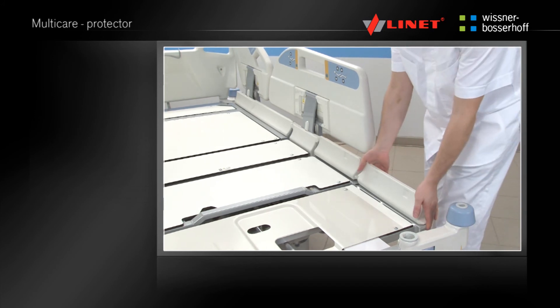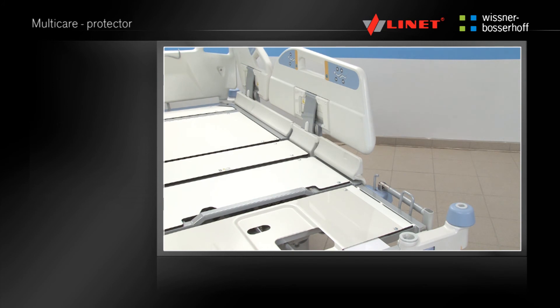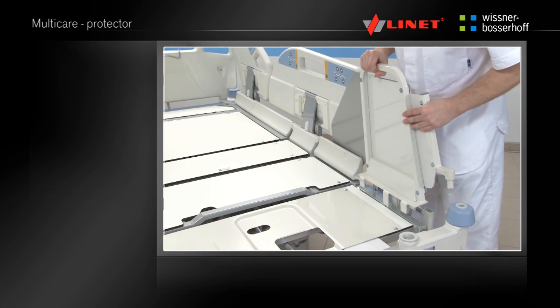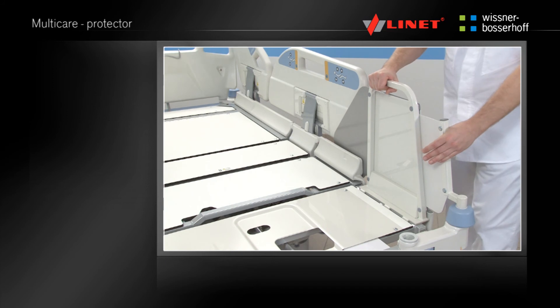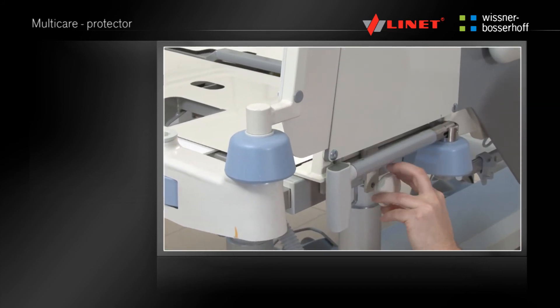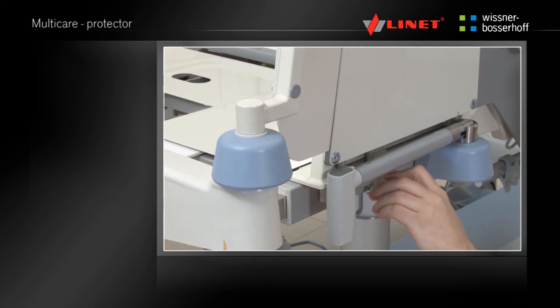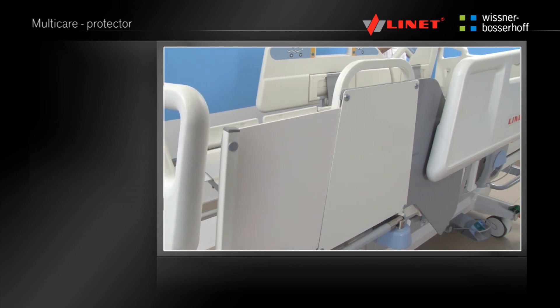The bed can be equipped with a protector. Pull off the plastic protective cover. Install the protector in the port near the foot end and sit the protector on the frame of the mattress platform so the board is between the side rail and mattress platform. Tighten the screw. The protector is functional for all positions of the bed.